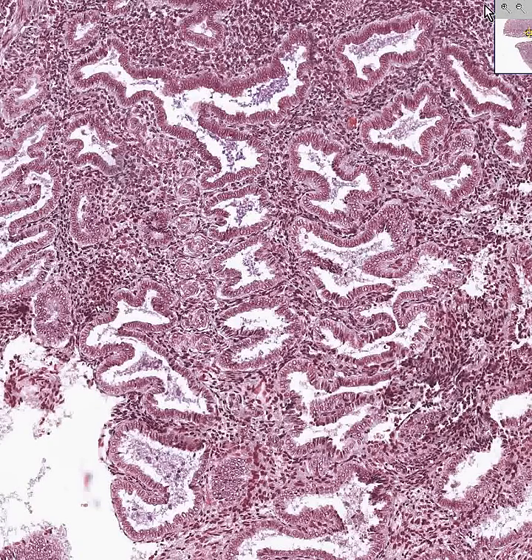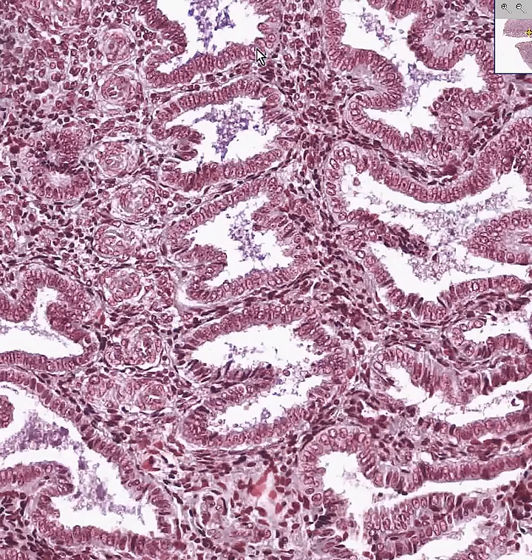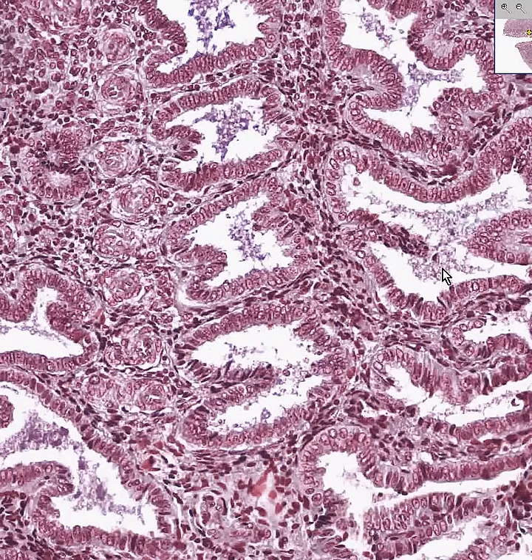But let's just take the two most important features that we can compare to proliferative endometrium: it is very hard to find a mitotic figure in the gland or the stroma, and there is an abundance of secretion in these glands.